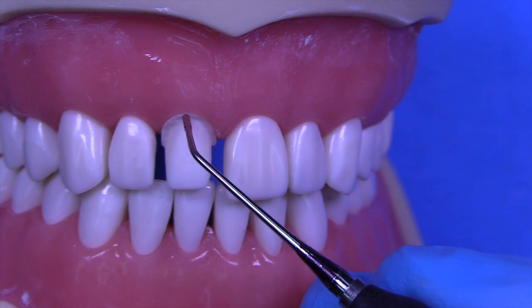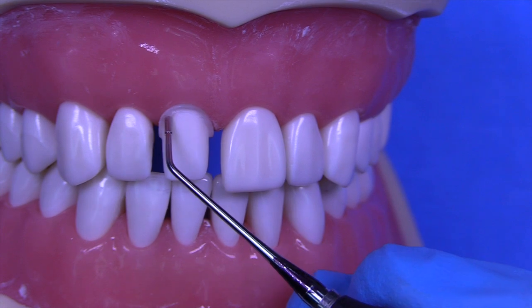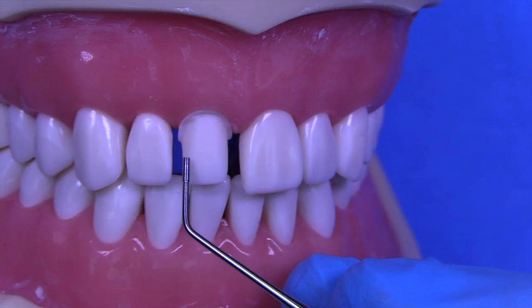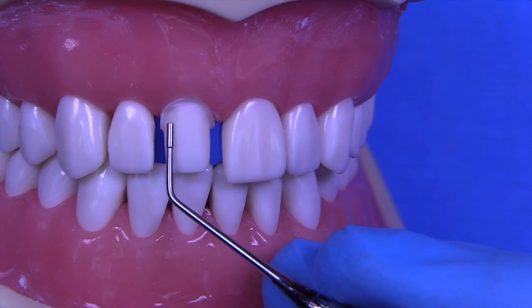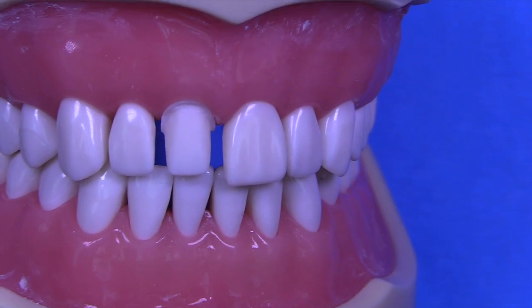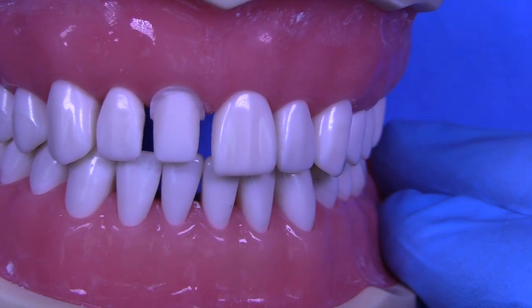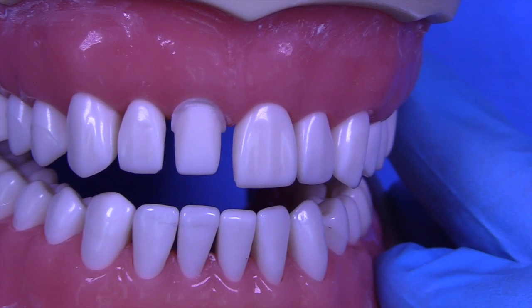As far as your scallop is concerned, you followed your gingival area very nicely, very uniformly, except right here you get a little bit subgingival. So that would have been an area that I would have tried to have gone a little bit less. On the distal side, you brought your margin up quite a bit above the tissue, sort of following the normal pattern of a papilla, where in fact this typodont does not have a papilla, so you would want to have that margin closer to the tissue. The line of draw of the prep looks decent. I don't see much of an issue with that.